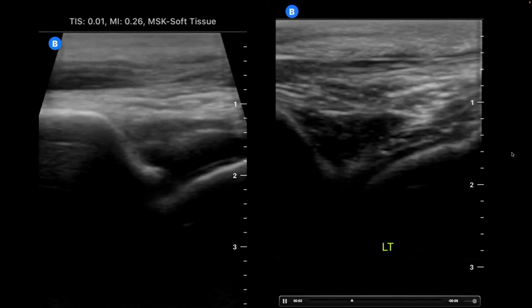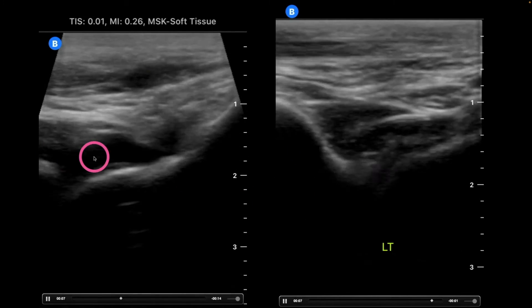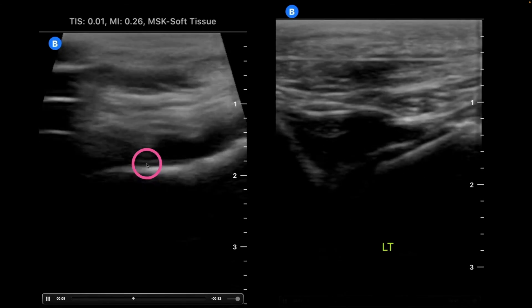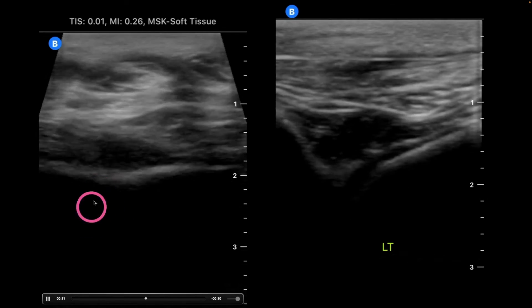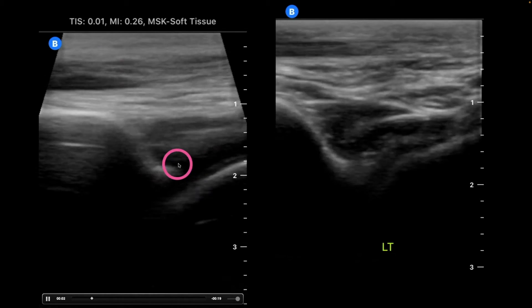Here we have a patient without an effusion — this is the joint. And then here is the same patient but with some swelling and some pain on the affected joint, and we can see that there is fluid right here in that ankle joint.